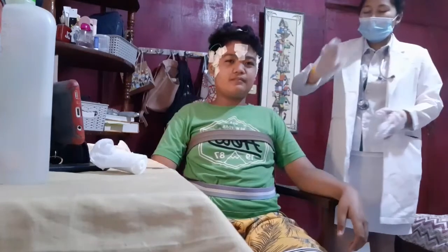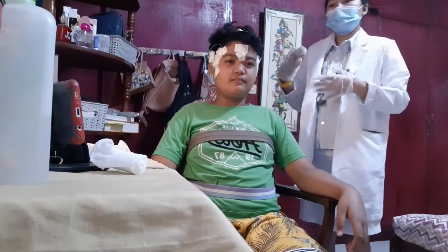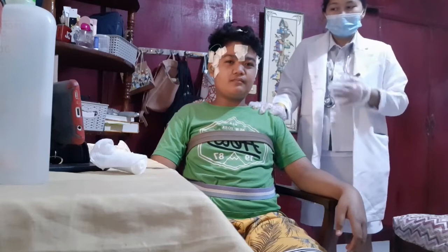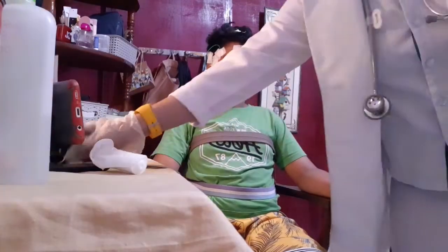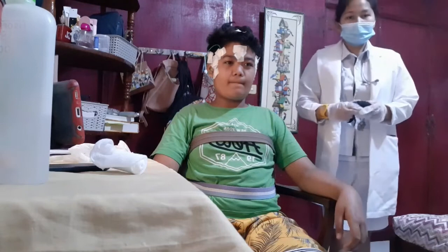Sir, the purpose of the flexible belt is to measure your breathing pattern and to determine if there is a problem with your breathing pattern. Okay, so next is the pulse oximeter.